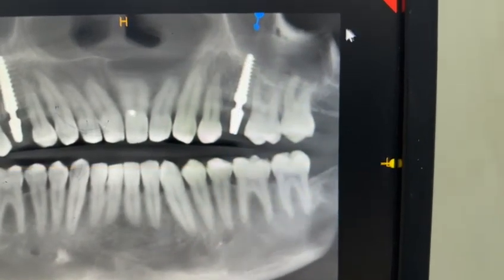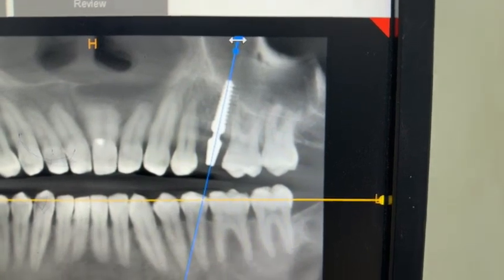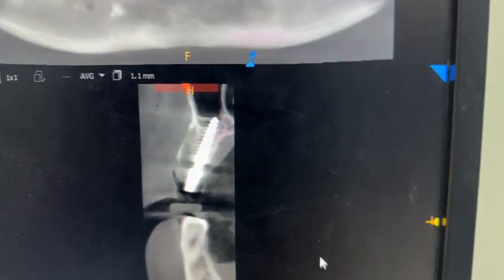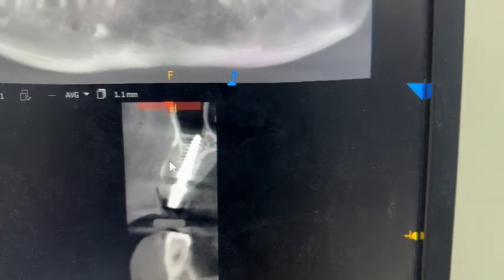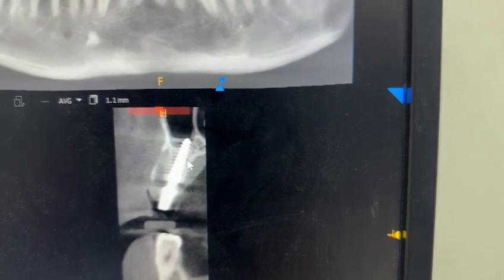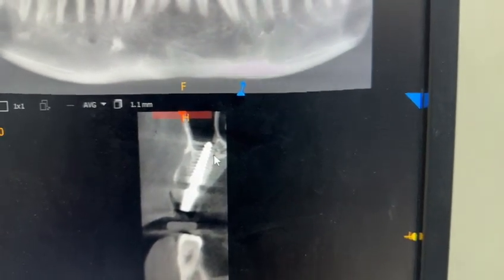You can see it is getting engagement from the sinus floor, as seen in the panoramic view. In the cross section, it is getting engagement from the sinus floor, almost 2-3 mm into the sinus floor. This is the extraction socket of the buccal — that means we would have placed it in the palatal socket. This was done in August 2021.